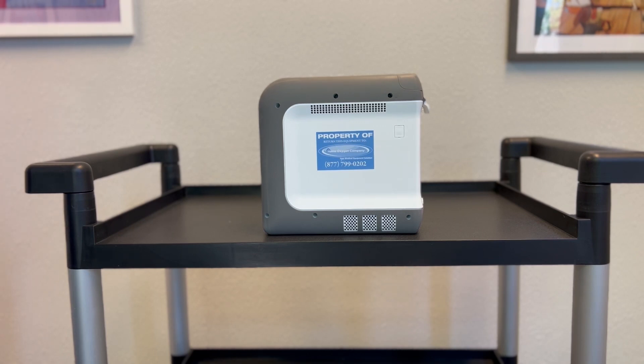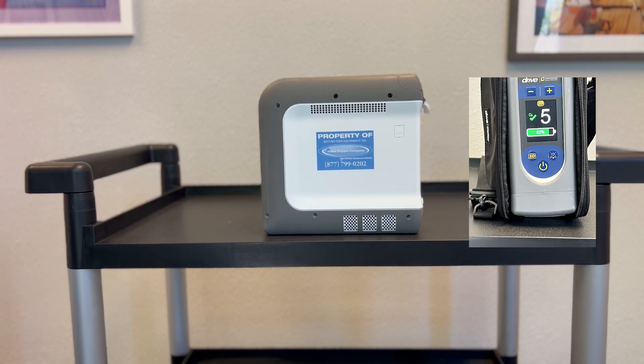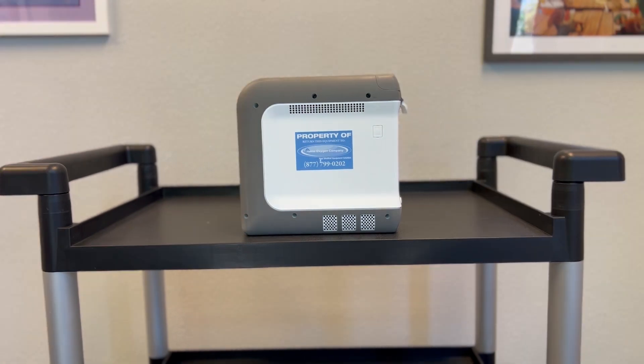Specifications for the Drive DeVilbiss iGo 2 include pulse settings of 1, 2, 3, 4, and 5 — there are no half settings. The iGo 2 features Smart Dose Technology, which when enabled automatically adjusts the oxygen dose in response to changes in your breathing pattern. It delivers more oxygen when needed to help you stay active and saturated, giving you the freedom and confidence to live a more active life.